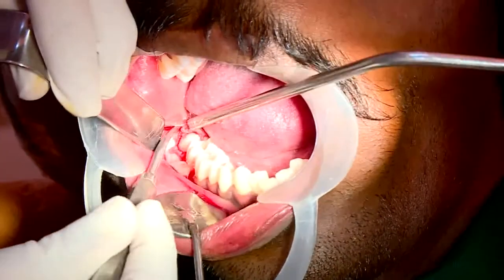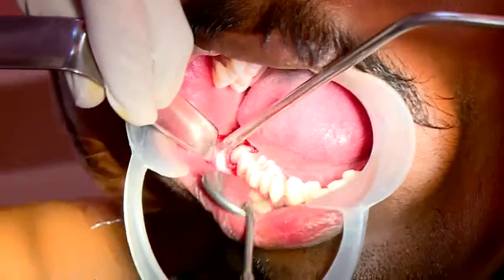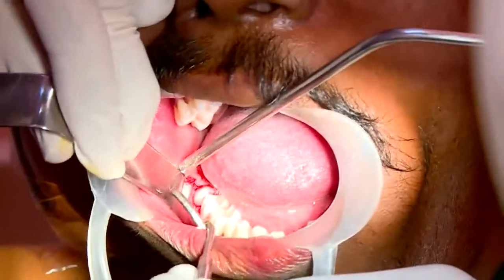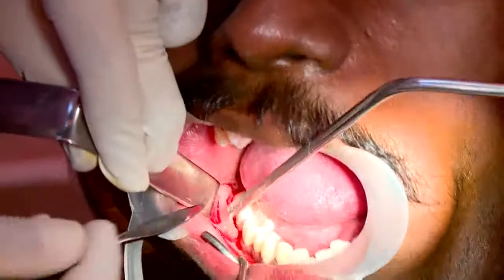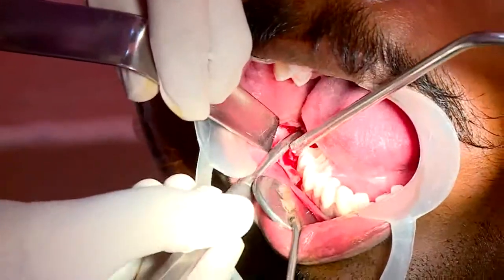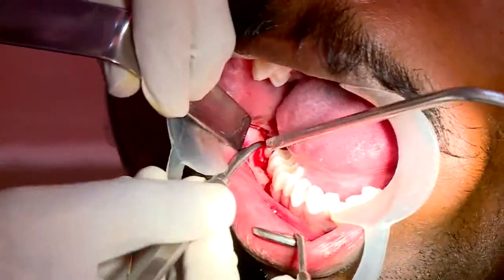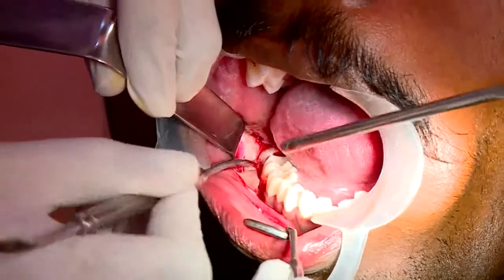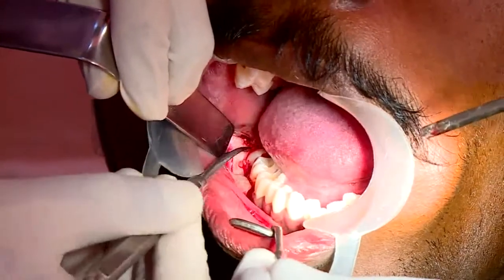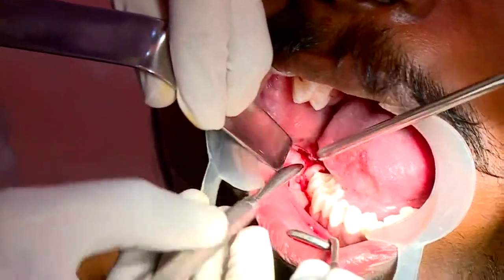Now we take the hook end of the retractor. You place the hook end on bone, not on soft tissue. The hook end should rest on, like I said, the ascending ramus. It holds the tissue. Can you see the loss of blood? No bleeding at all.